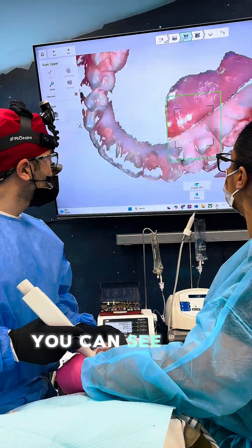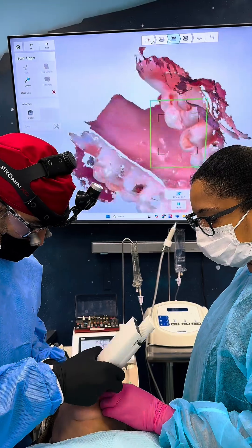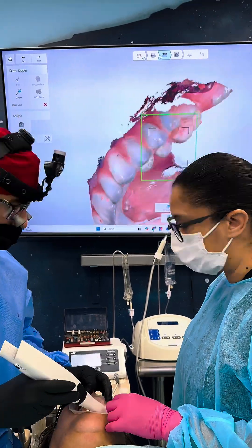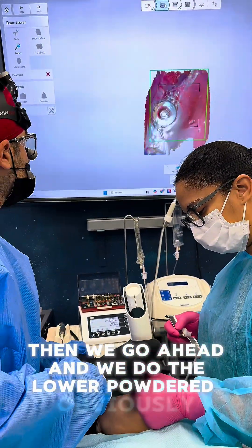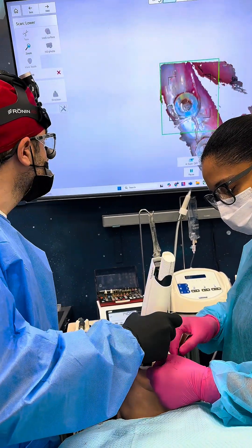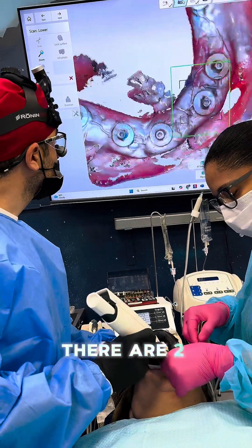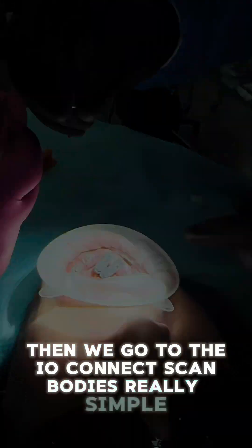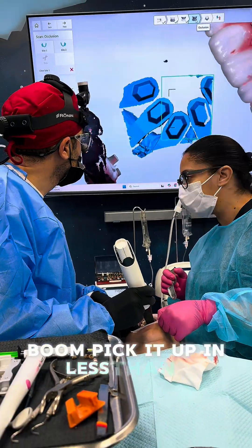I scanned the upper all over again with the Trios - you can see how fast and beautifully it scans with no issue whatsoever. Then we did the lower with powder and you can see how fast it picks it up. Because of all the pressure from the THS caps - all two millimeters - there's essentially no blood. Then we go to the IO Connect scan bodies: really simple - only one large, a couple mediums, a bunch of smalls. We go into the bites module and it picks it up in less than seven seconds.